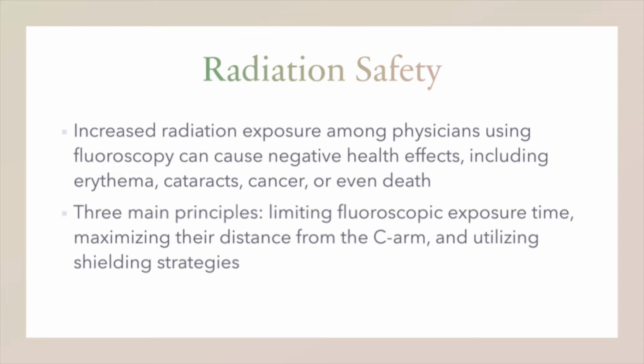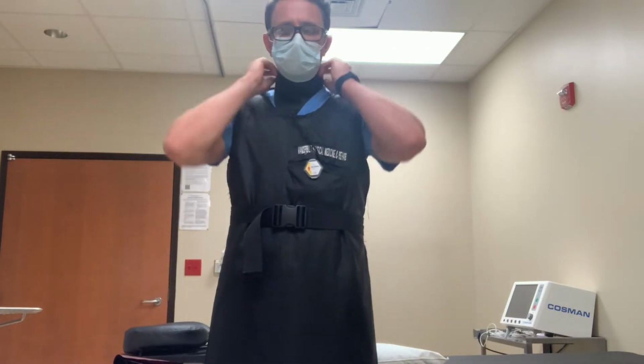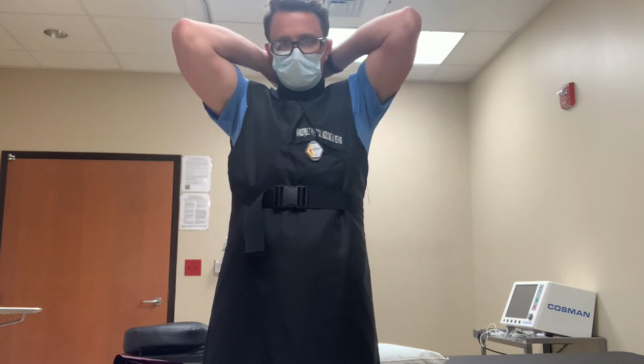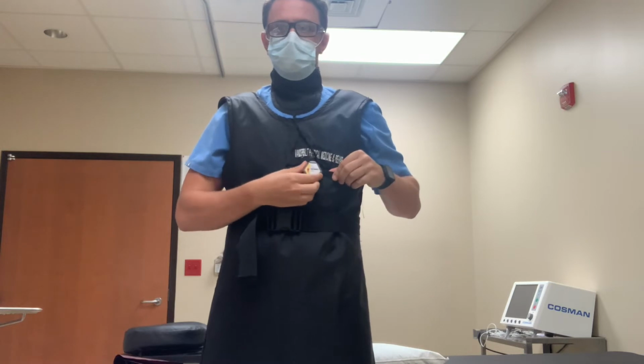Lastly, we will go over some strict shielding techniques that should be enforced. Everyone in the procedure suite should always be wearing their lead vest, thyroid shields, lead glasses, and a radiation badge for radiation monitoring.